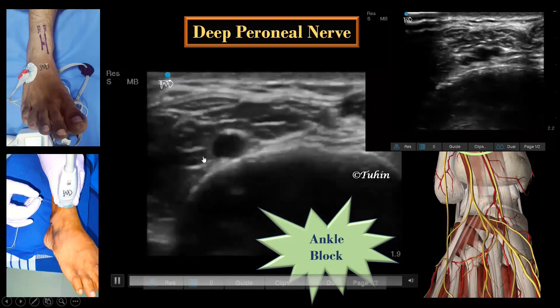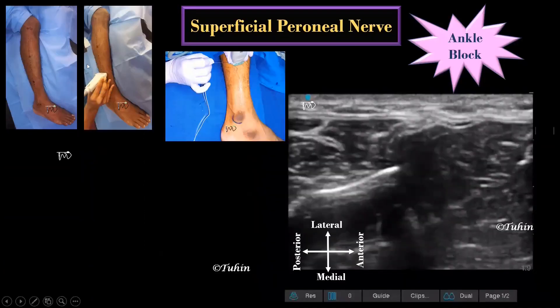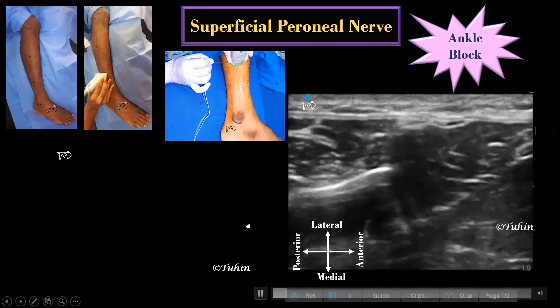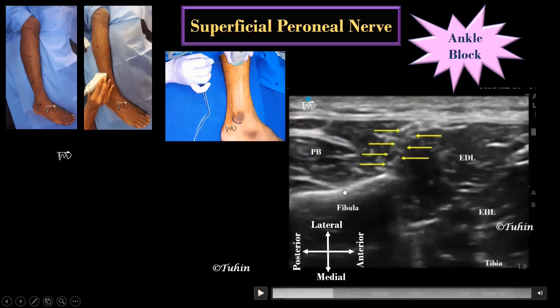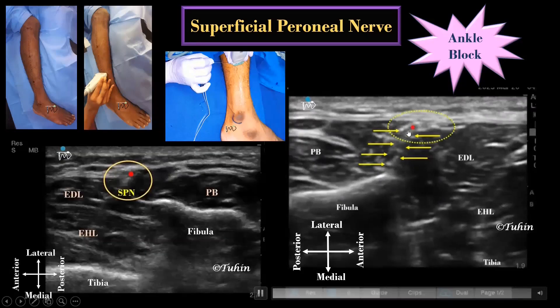For the superficial peroneal nerve block, the transducer is placed in transverse orientation about 10 to 15 centimeters proximal to the lateral malleolus — at the junction of the proximal two-thirds and distal one-third of the line joining the lateral condyle and the lateral malleolus. First identify the hyperechoic line of the fibula as the bony landmark, then another hyperechoic line connecting the fibula with the crural fascia — this is the intermuscular septum separating anterior and lateral muscular compartments.